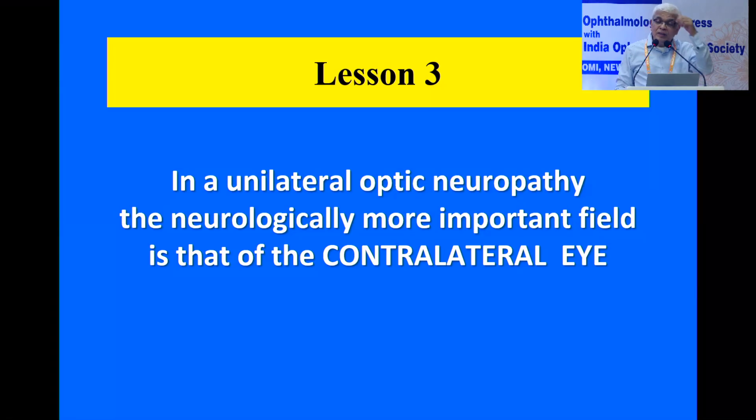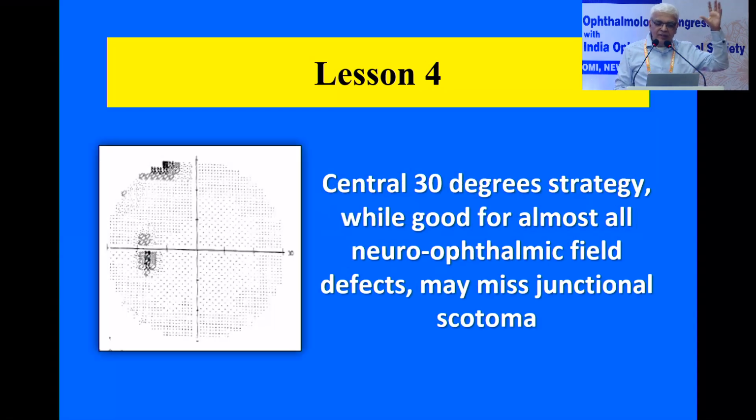How is that eye on the other side with the 6/6 vision? How is its field? And if you see some kind of a temporal defect on that side, be careful there. Okay, which also brings us to our 30-2 tests.